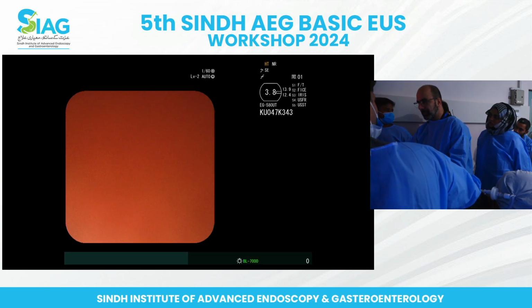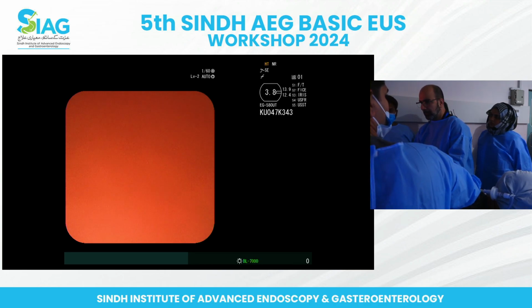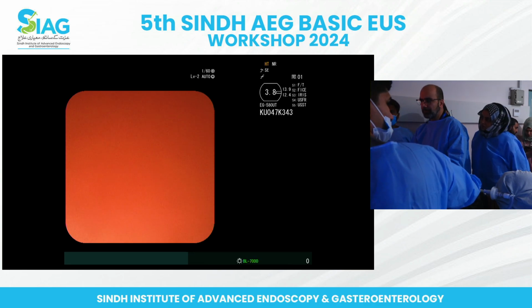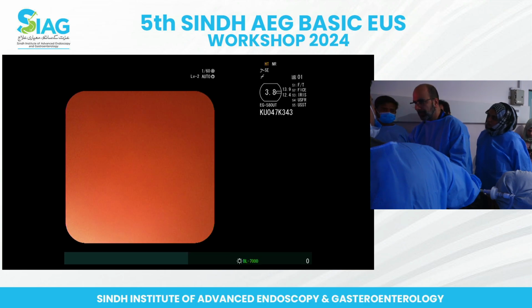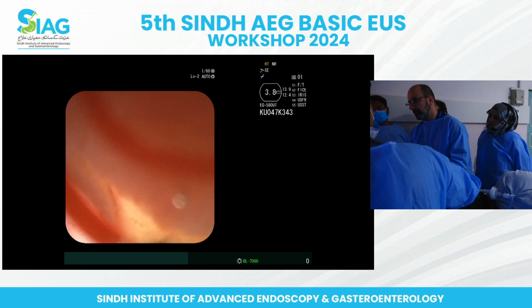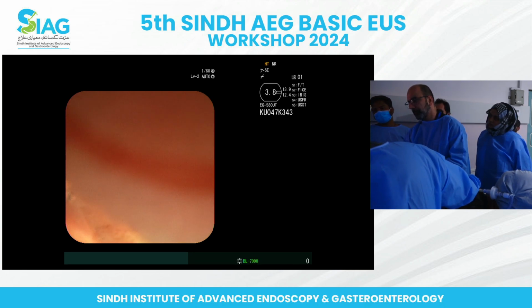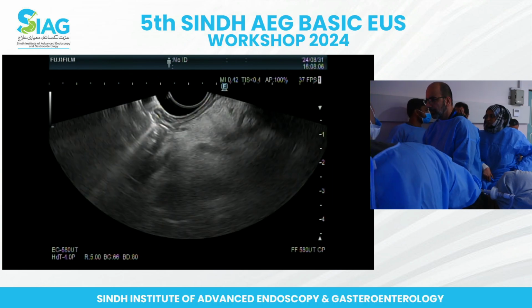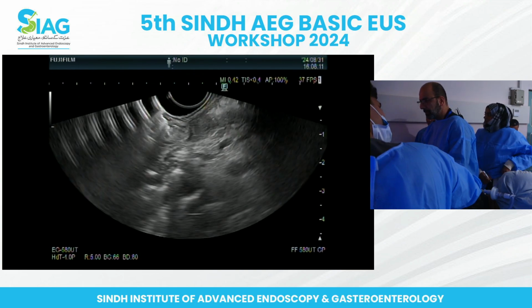There's right there, there's a bit of a hypoechoic region, right there. Which may or may not be. So we can get a needle here and biopsy this. But it's small. I don't know if this is truly lesional or not. Needle, Dylan, 11.5 by 7. But this is like the most abnormal looking thing we've seen.